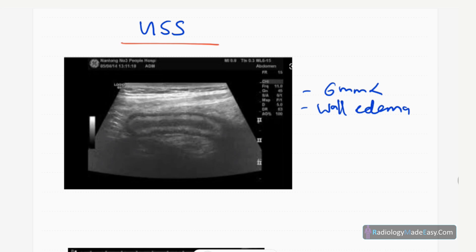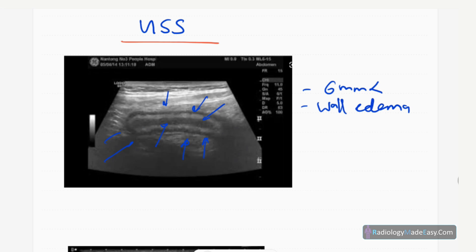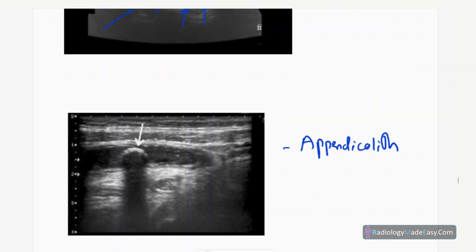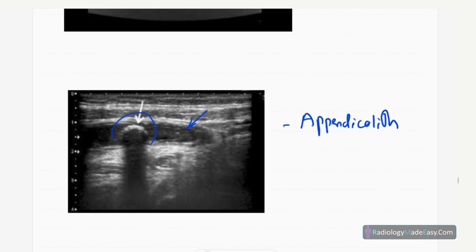Ultrasound is also highly important. In the RIF region, you can see the appendix in longitudinal view — a dilated appendix usually more than six millimeters in cross-section with wall edema. This is the mucosa and this is the lumen — wall edema with a dilated appendix is highly suggestive of appendicitis. In another image, you can see a hyperechoic structure with acoustic shadowing, indicating an appendicolith causing obstruction of the appendicular lumen.